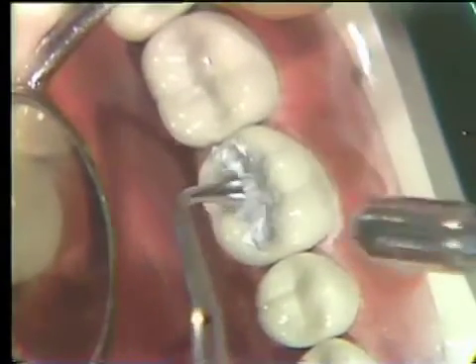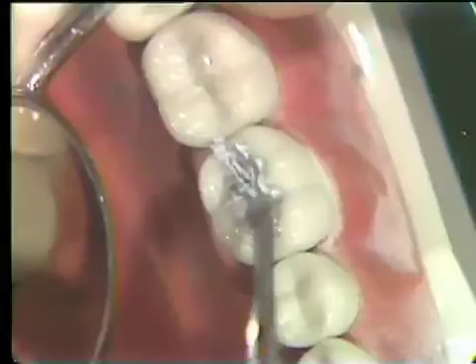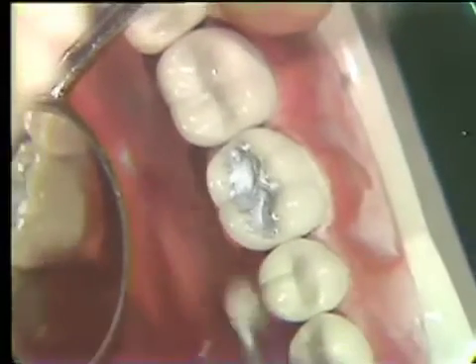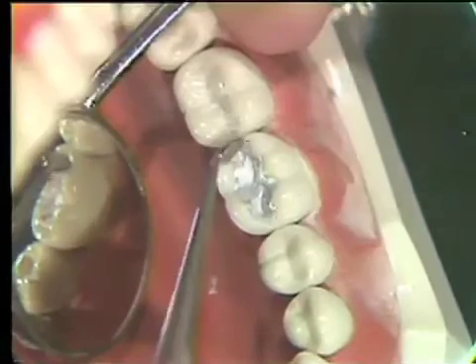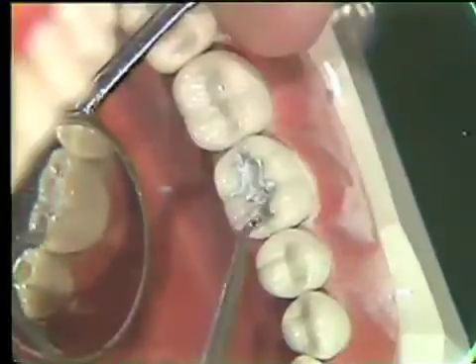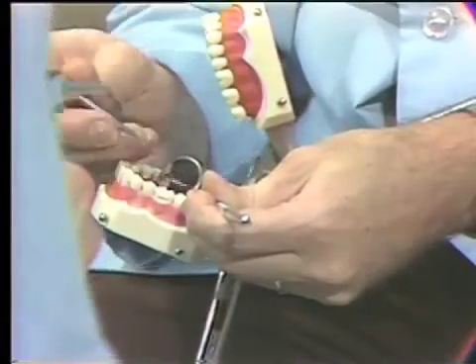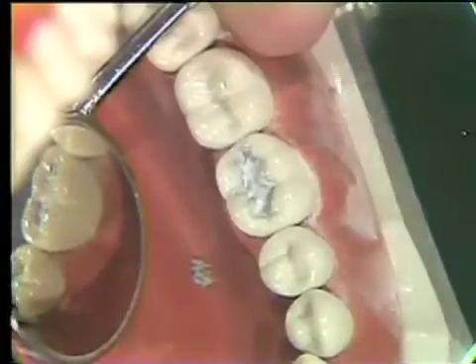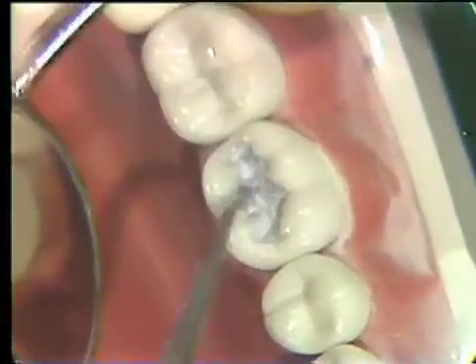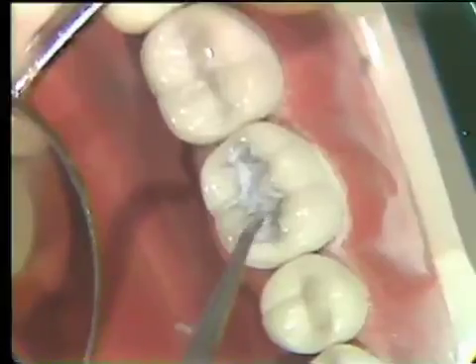This is our burnisher. At this stage, while it's still soft, we'll just go over and burnish the restoration — this helps to give us a better surface texture. We'll begin our carving with a fairly large round-type instrument and just take the excess off. If we keep this well onto the tooth surface we shouldn't remove any of the excess alloy beyond the margins. You'll find this same principle applies with your polishing. If you're carving or polishing with a large round bur, we keep it onto the tooth structure and don't generally remove too much alloy at the margin.